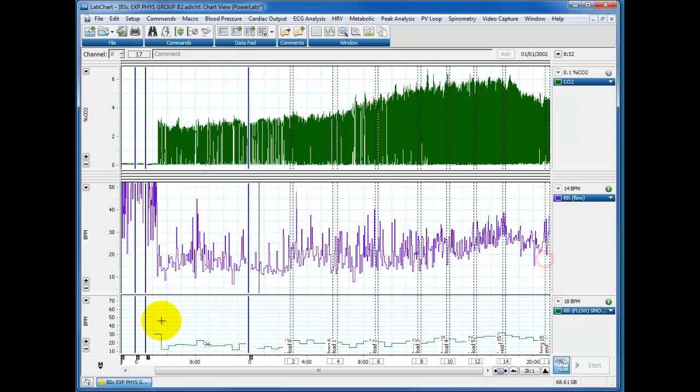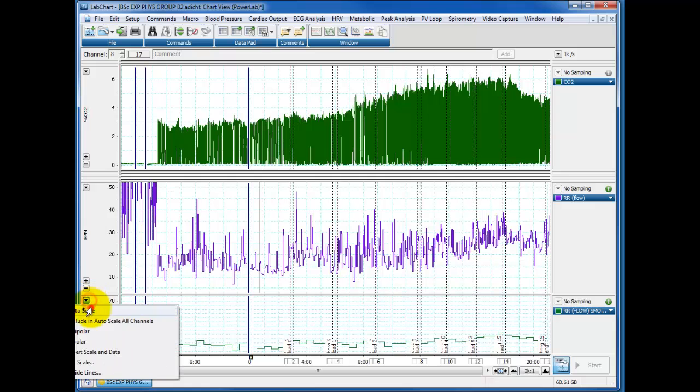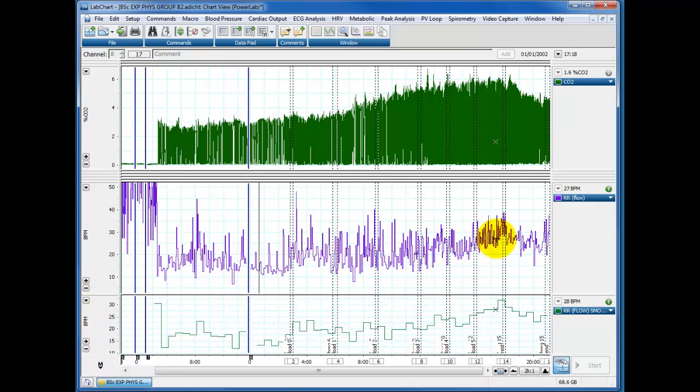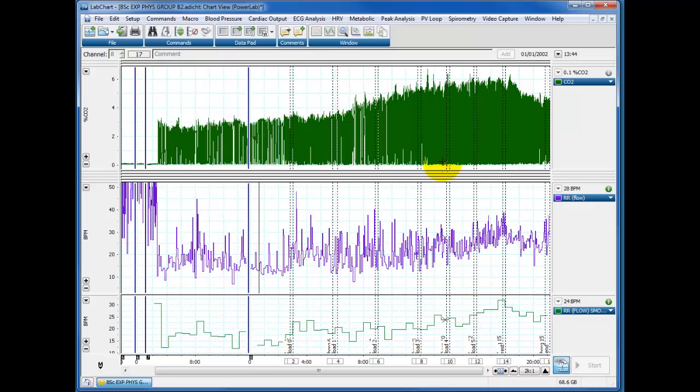And again, we see exactly the same trend. It's going from around fifteen to twenty up to around thirty. So the two different types of analyses from the two different traces give us the same data, which we'd expect, because they were taken from the same person at the same time.